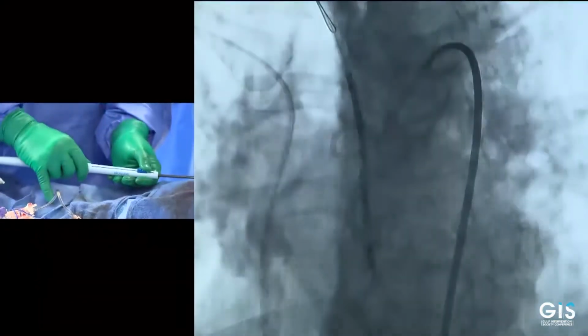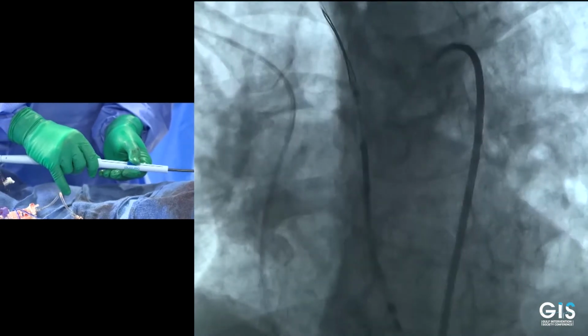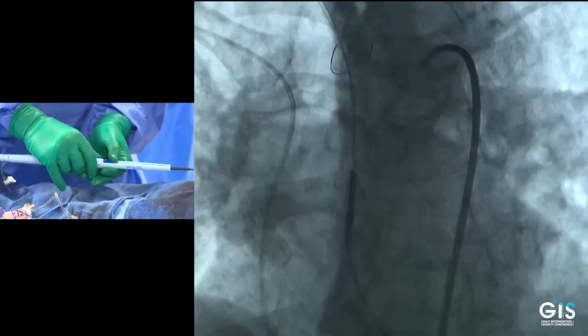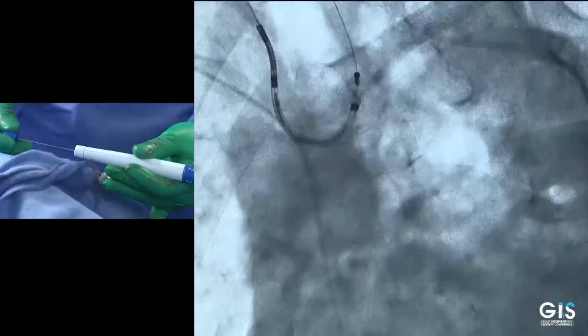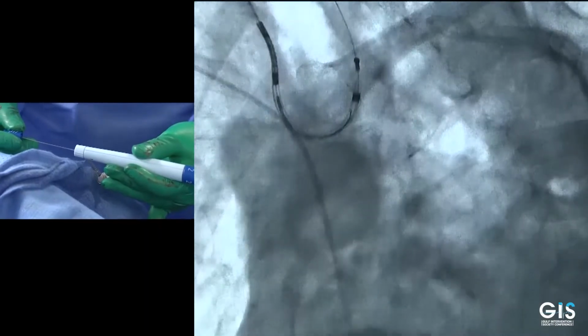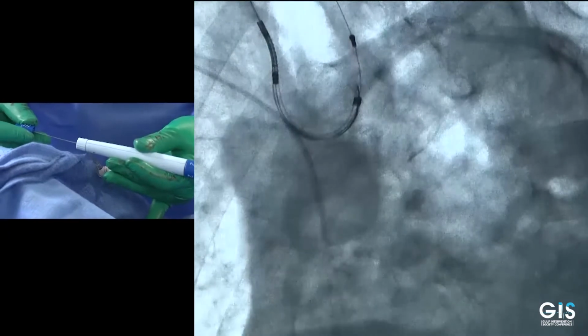So as you can see here, the proximal basket is going to be released now. Dr. Fahad is doing this. Okay, you can see it opening now, and it's opened, and it's in a good position. Now we have the wire in the left common carotid, and we have the catheter also situated in the left common carotid. Now what we're going to do is deploy the distal basket by pushing knob 3.